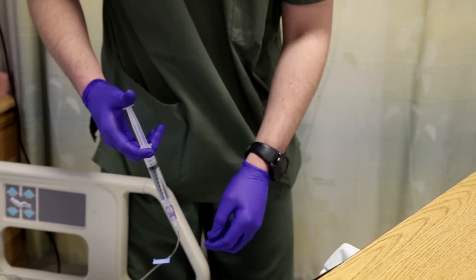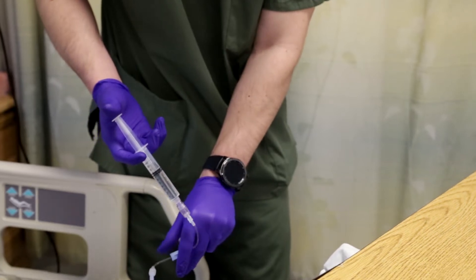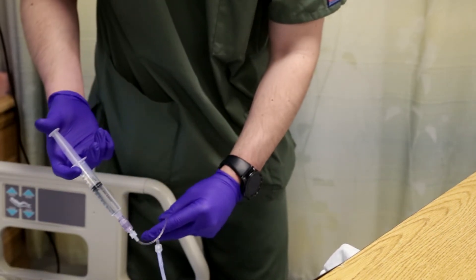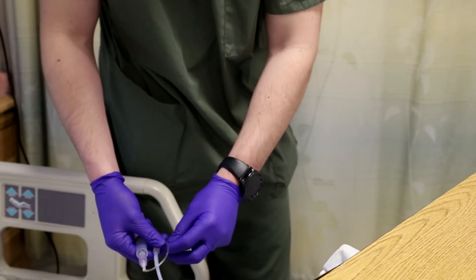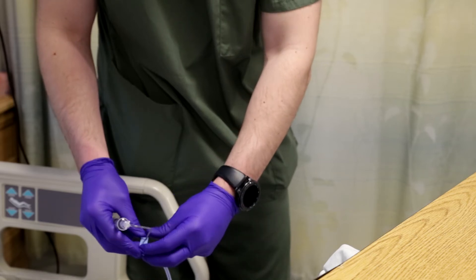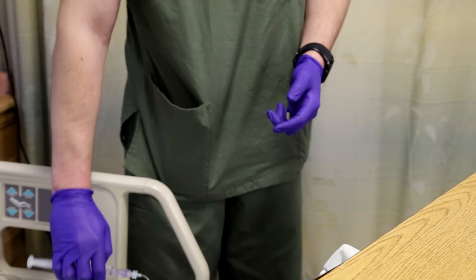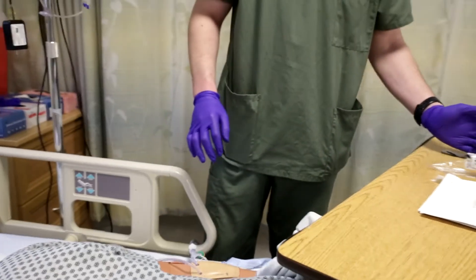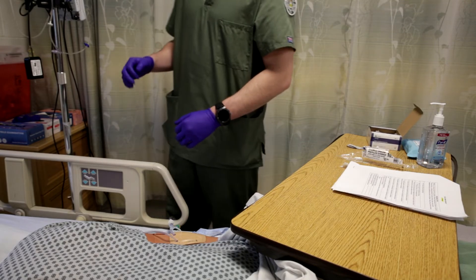Perfect — no resistance. Without letting go, I'm going to re-clamp it. The syringe acts as a pressure to keep the blood from going back into the line. I'm going to leave this attached to keep it sterile. Now that I've flushed it, it's intact — I didn't have any resistance or anything like that.